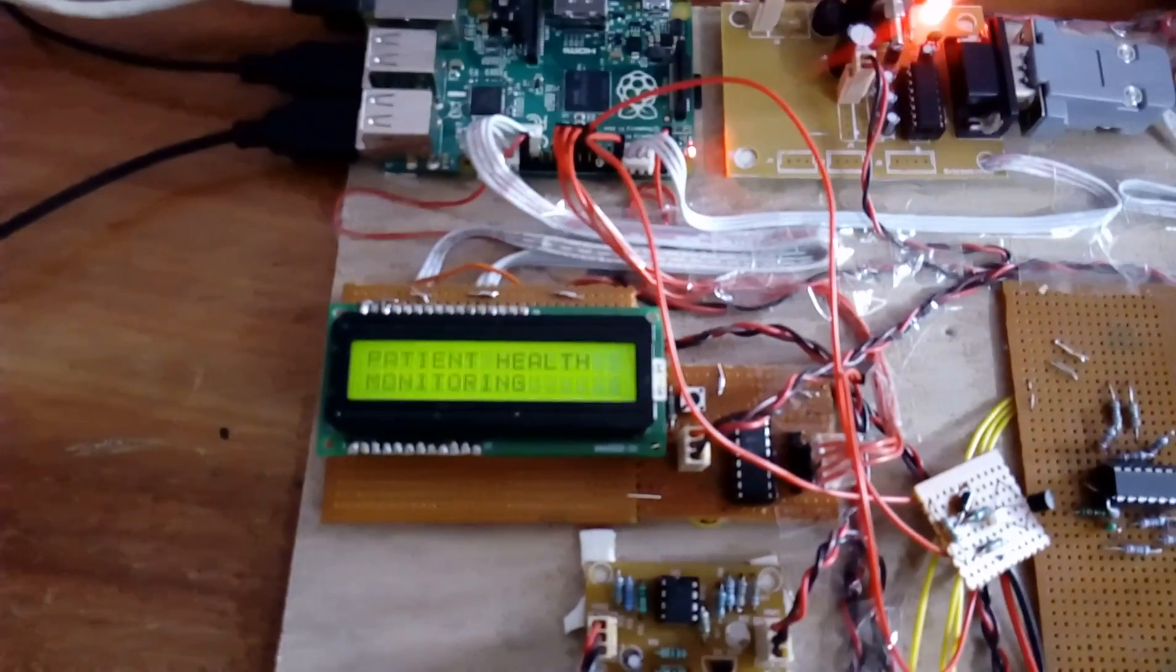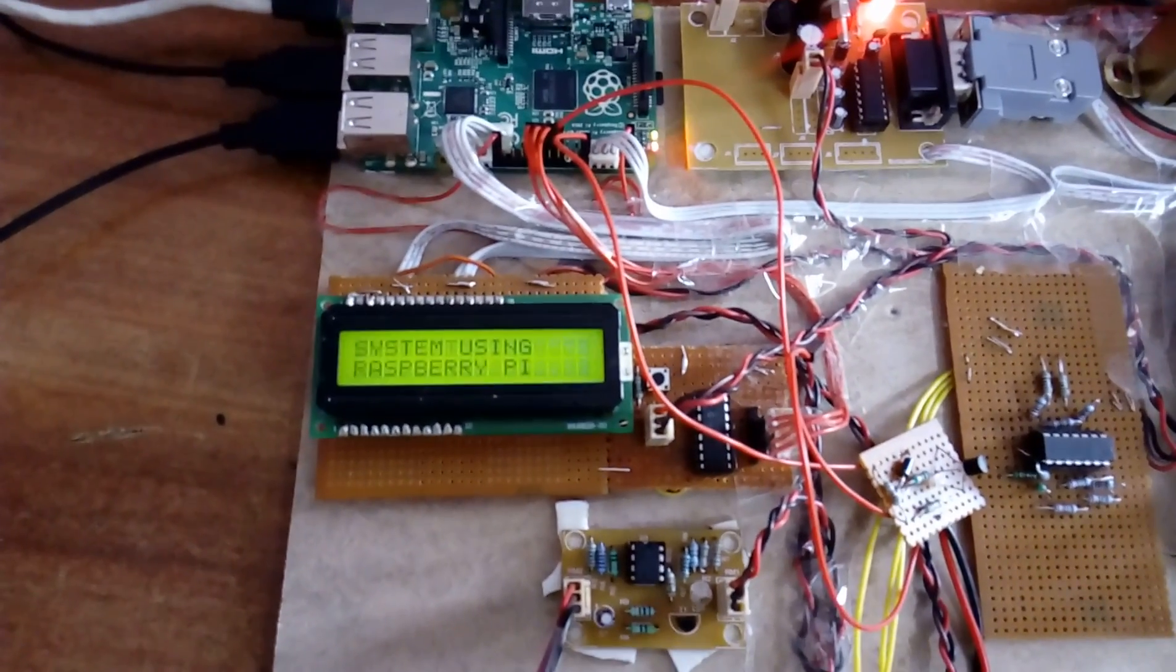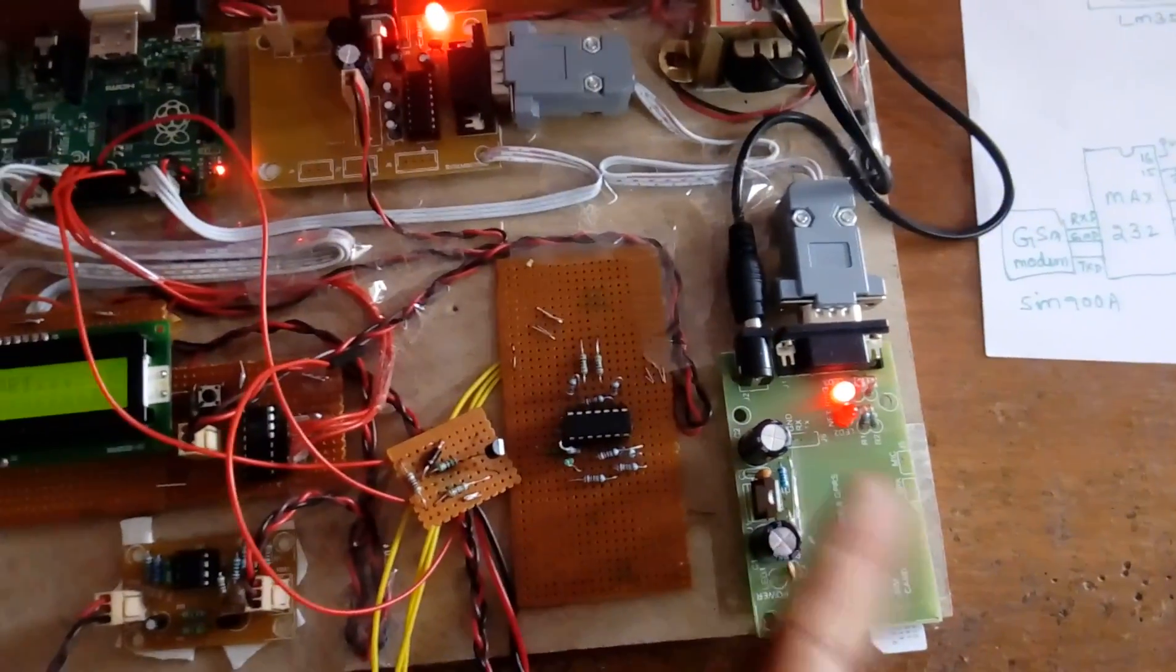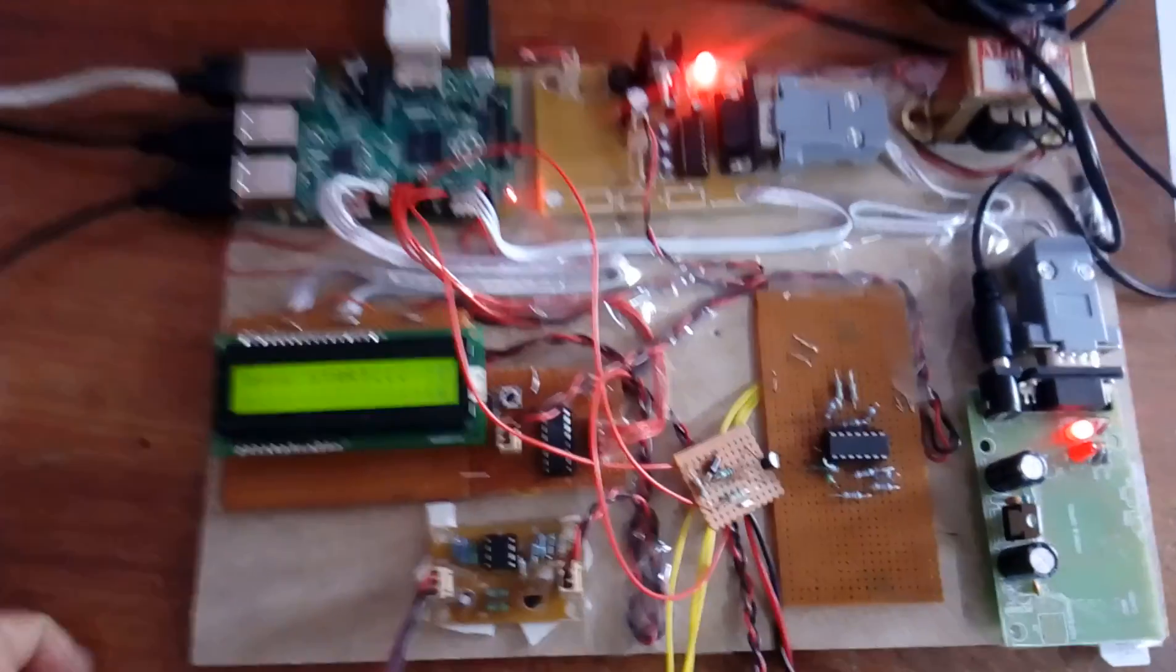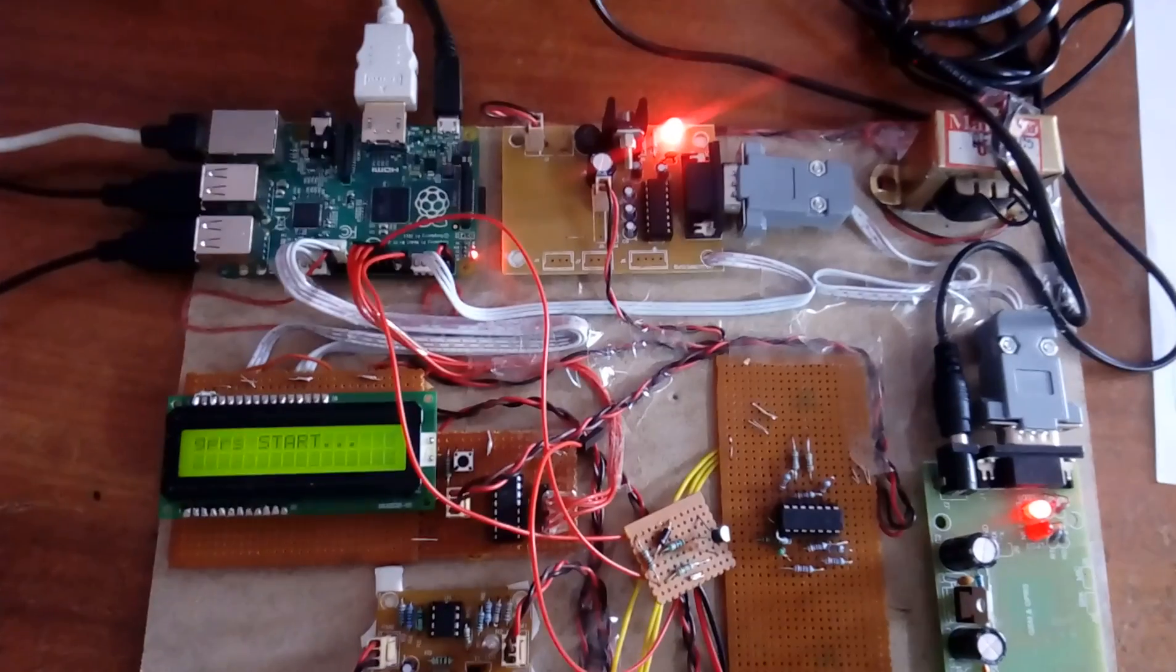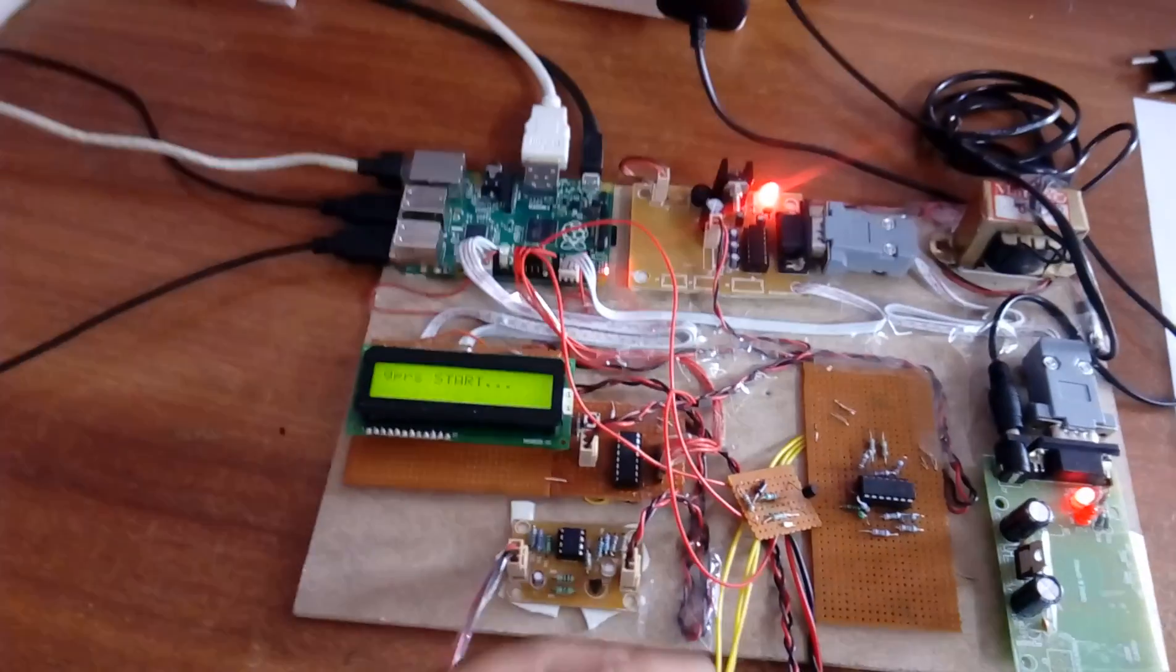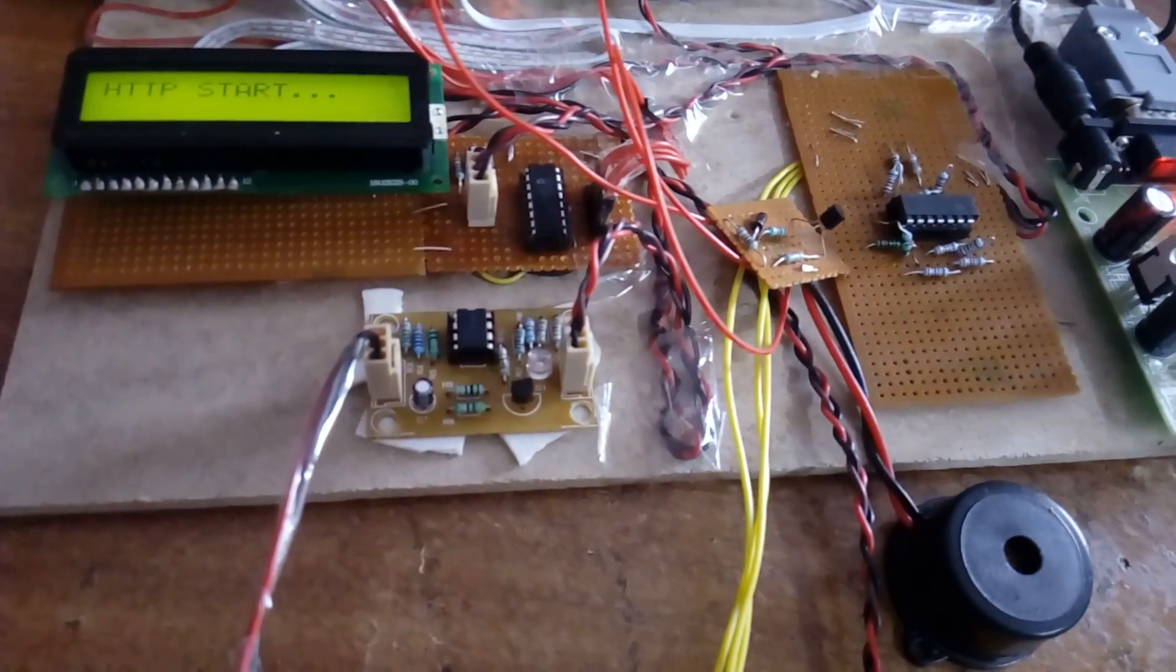You can run it directly here. It will show you Patient Health Monitoring System using Raspberry Pi and IoT. GPRS modem is connected, so GPRS starts. It will display a blank window: Patient Health Monitoring System using Raspberry Pi.